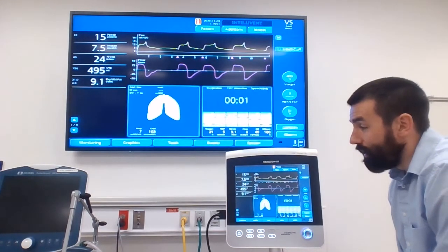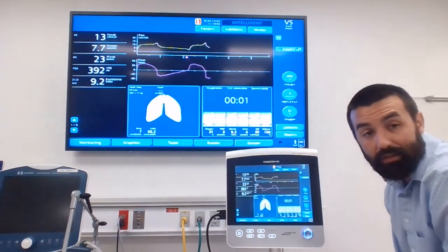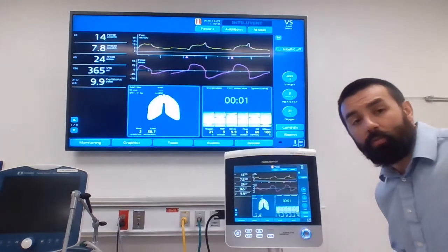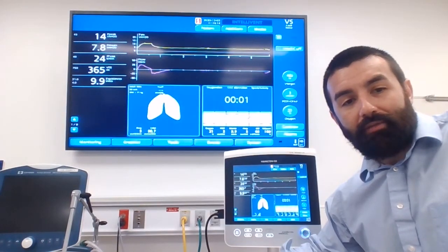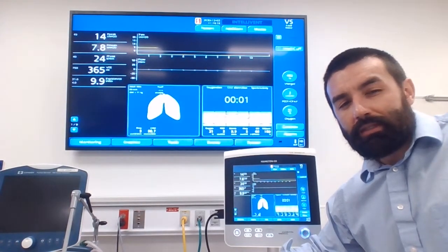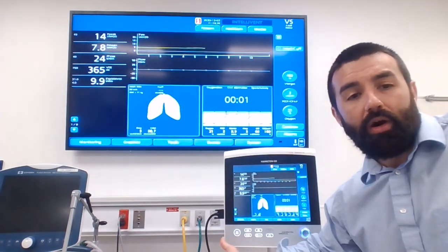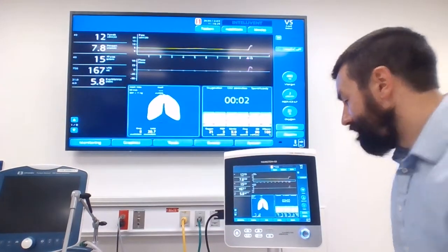You adjust the pressure support to get to that target tidal volume. So if they're reaching their target tidal volume at a low pressure and they look good, you can consider them for extubation. I don't know why we don't use volume support as much in the adult world, but I've used it a lot more in kids than in the adult population. I don't know if doctors don't know this exists, but it's another option on the Hamilton ventilator series, and you also see that on your Puritan Bennett ventilator series, the 840 and 980 and so on.